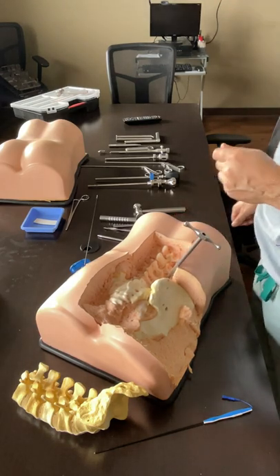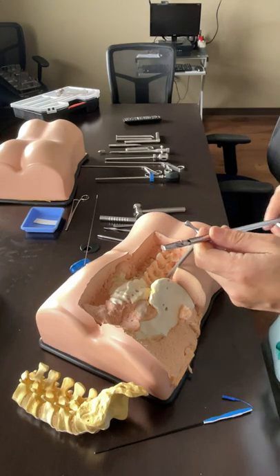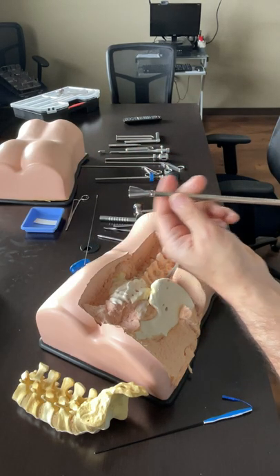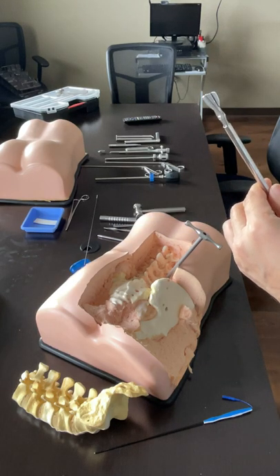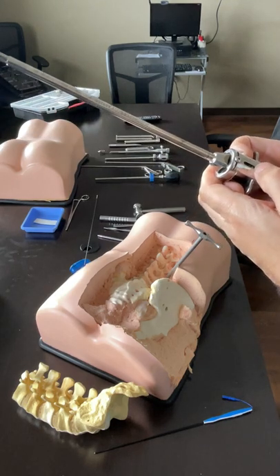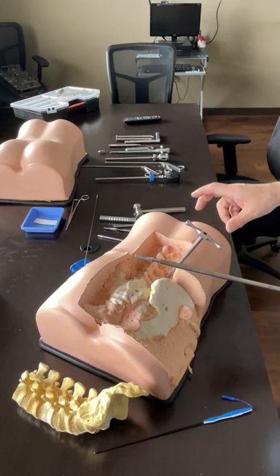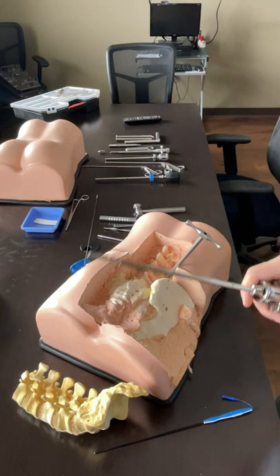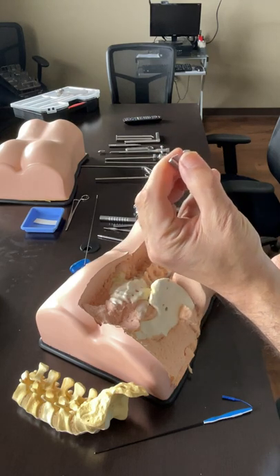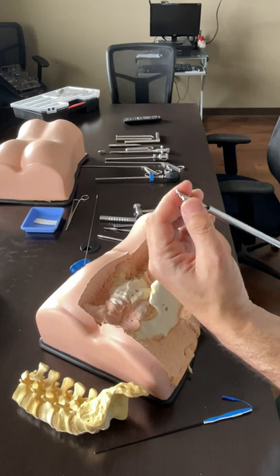The next step is using discectomy tools. First is what we call the fanning curette - it fans up when you pull it together, and fans it out when you push. If you push that, it can jump back. Once you pull it back into the tube, it closes passively. The numbers show how big your cage should be. Very important: this turns only clockwise. If you try to turn it counterclockwise, the fans may separate and you may break it. Always clockwise.